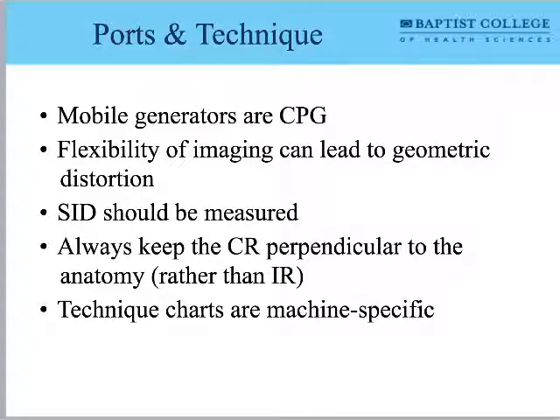Other considerations, last thing is low ratio grids are going to be your best friend for portables, so 5x1 to 6x1s, but we've not talked about grids yet, so whatever. Grid software is probably going to be making grids obsolete in the next 5 years or so. He talks about that on page 674. I agree with him on that, and he presented on it recently.